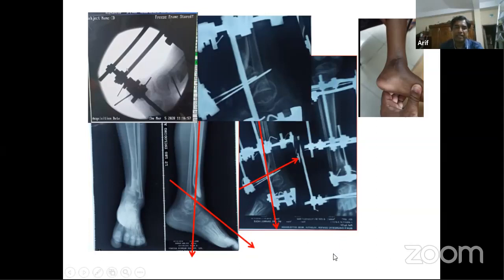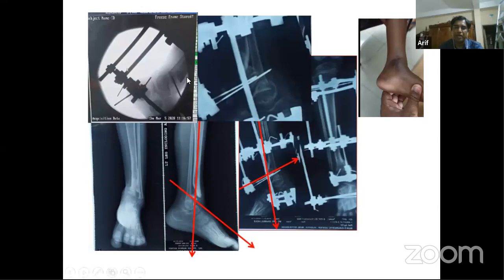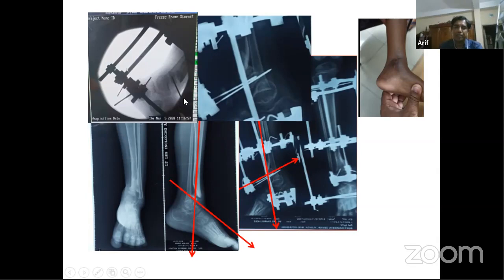Everybody of us thinks that the physeal plate is already gone. But I took the chance. If I give stability, and diminish the growth in the anterior part, I hope that any part of the physis may regenerate. So I put just two wires, and I put tension on these wires in a cantilever manner and fixed them to the Ilizarov ring. And after some time, follow-up of the patient is going on.